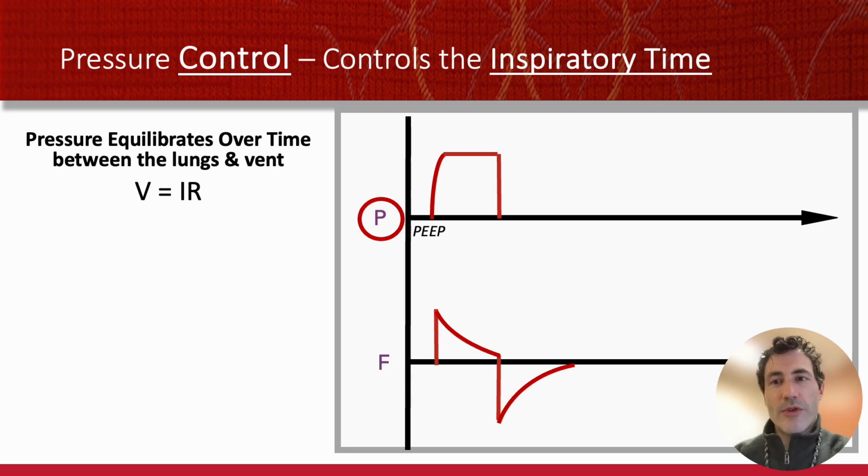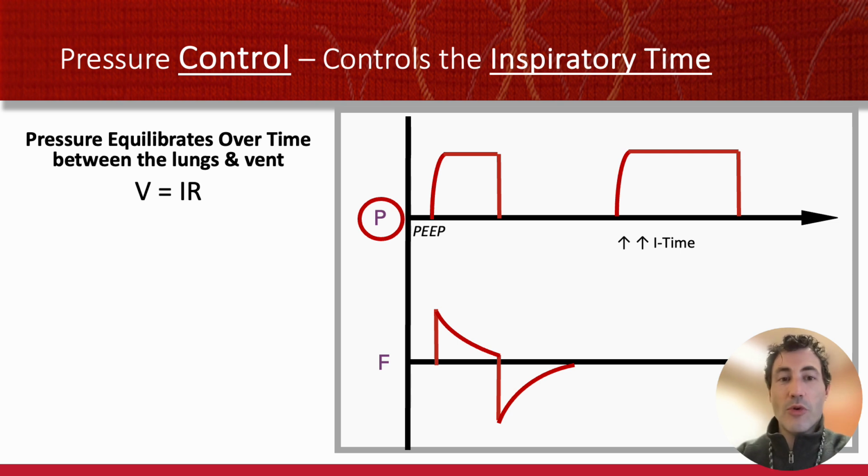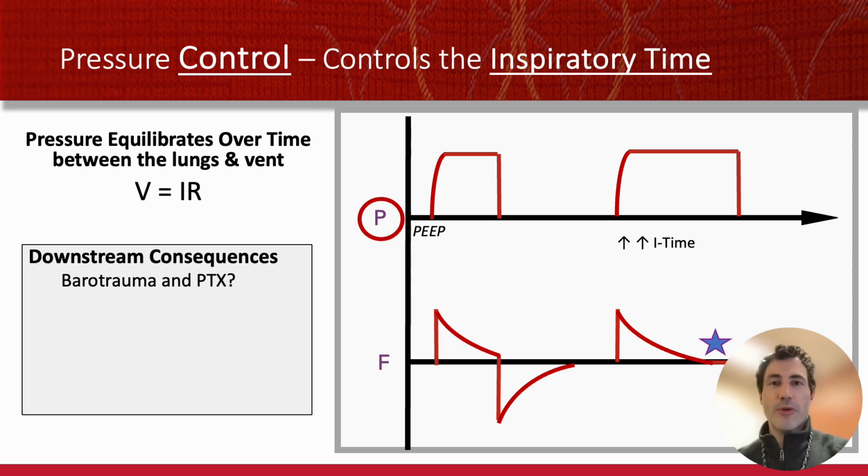So, we reviewed that you can mess up when you're setting the inspiratory time and make the breath really, really long, in which case at some point that flow will keep decelerating, but it will decelerate all the way to zero and you get an inspiratory pause. It's important to remember that an inspiratory pause doesn't add pressure. The pressure is set. It's set by you. And it doesn't add volume because it's simply holding your breath full. It's breathing like this.